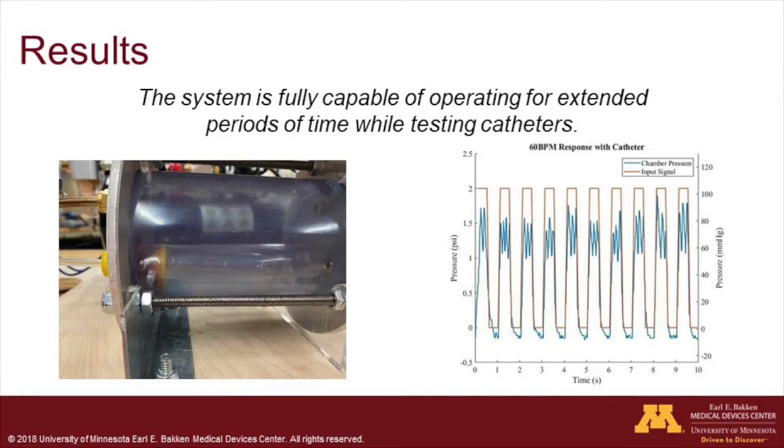In conclusion, we believe the novel method of converting a nonlinear fluidic model to a linear electrical model allowed low-cost components to be used in an efficient way. Subsequently, we believe this system provides an effective alternative to current test platforms available on the market.